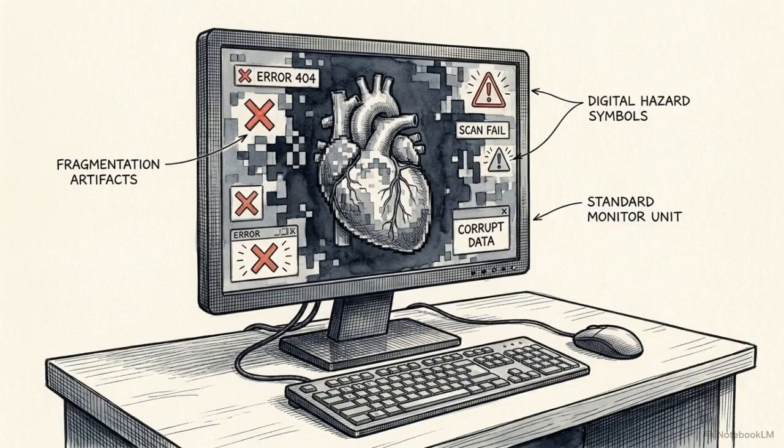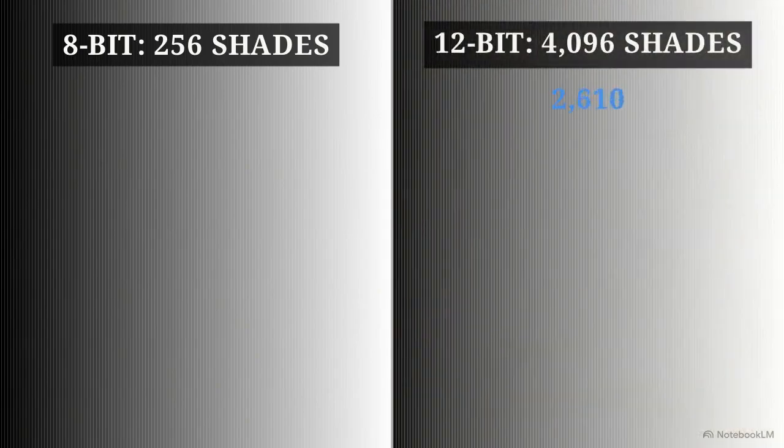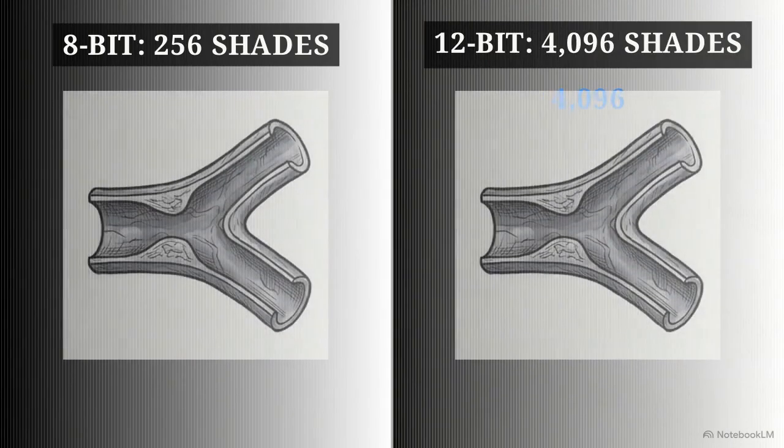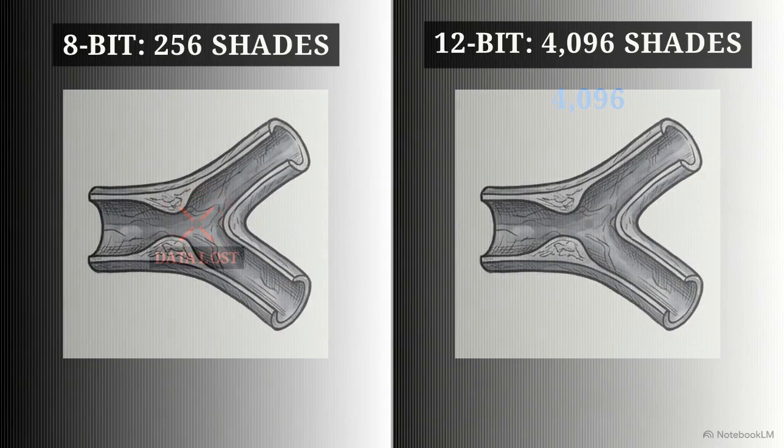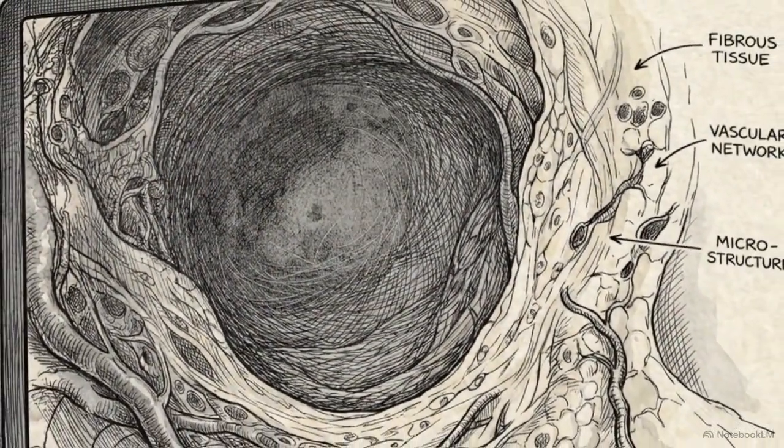Commercial off-the-shelf displays cannot process medical data safely because they rely on 8-bit processing, which maxes out at exactly 256 shades of gray. This diagram compares standard rendering with medical-grade rendering. On the left, an 8-bit gradient exhibits harsh, stepped banding. On the right, medical-grade displays utilize 12-bit to 16-bit processing to render thousands of continuous grayscale transitions. When a scan is overlaid, critical microstructures hide inside the crushed bands of the 8-bit side. The expanded 12-bit depth preserves the subtle density differences between soft tissue and contrast dye. That expanded processing depth prevents a lethal pathology from vanishing into a crushed black level on the screen.